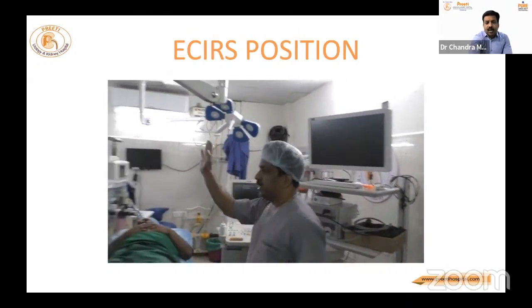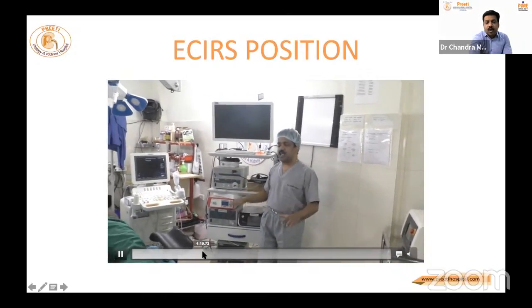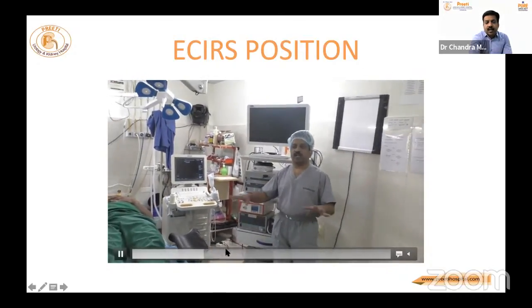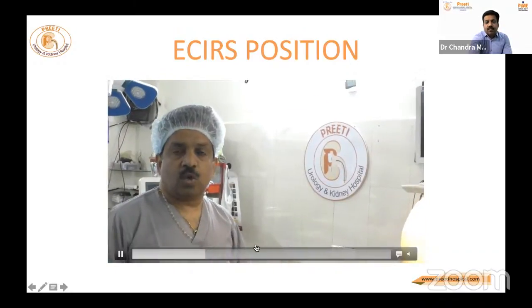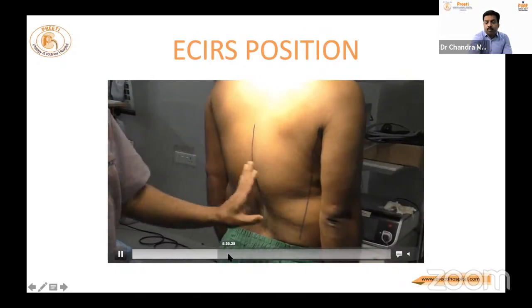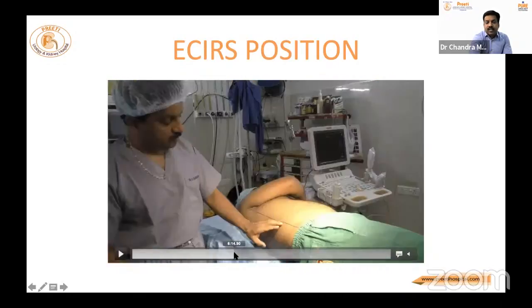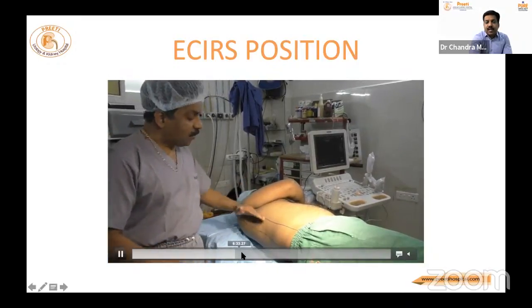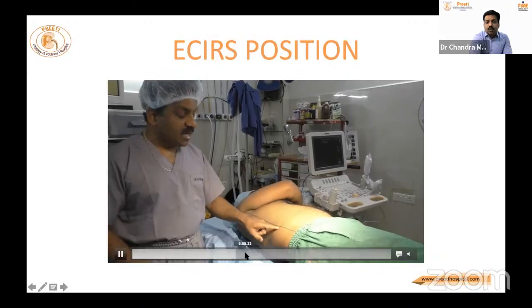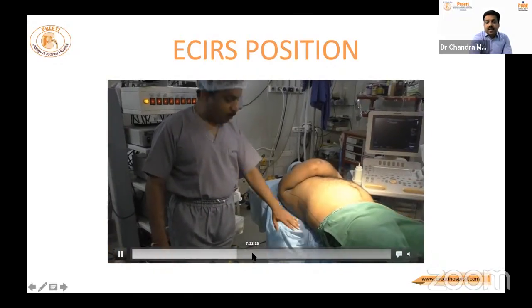You can arrange two monitors on either side of the patient like this, and the C-arm will always be on the opposite side for the supine PCNL, whereas for RIRS, the C-arm is not very important. Now, the posterior axillary line should be drawn in the standing position before giving anesthesia. Otherwise, you will produce a line which is much more anterior, and then it is dangerous. The posterior axillary line is the line drawn when the arm is by the side.